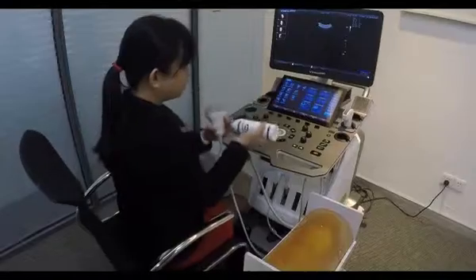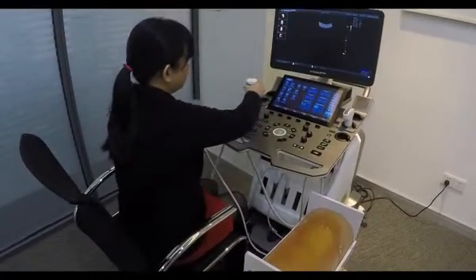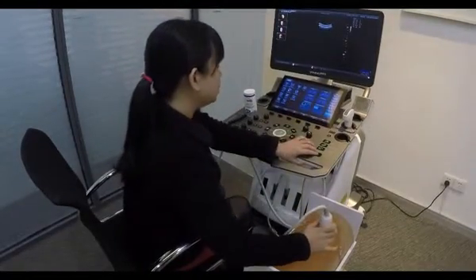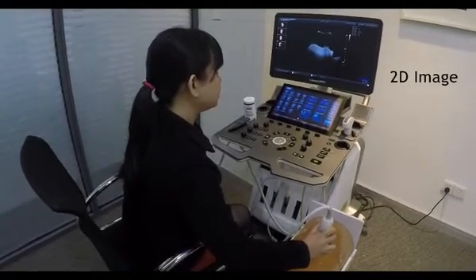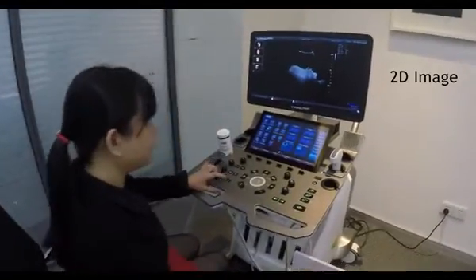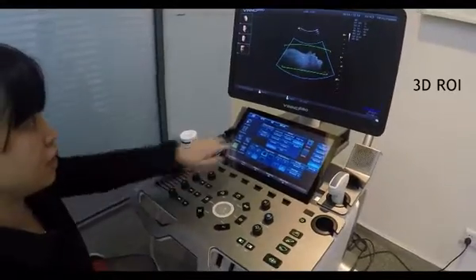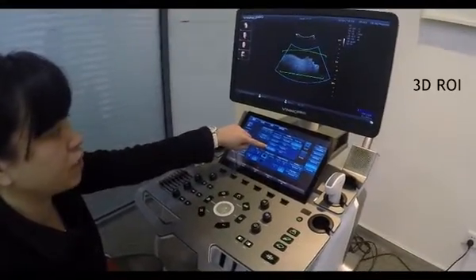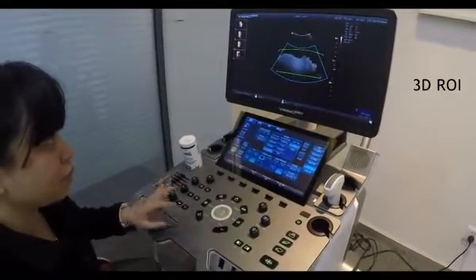Now I will do a scan on baby face. I'm using a 24-week phantom. First I get the 2D image of the baby face and then I press on the 4D start button. In the touch screen menu I have to make sure I select the HQ surface mode. After this I can just press the 4D button to start.